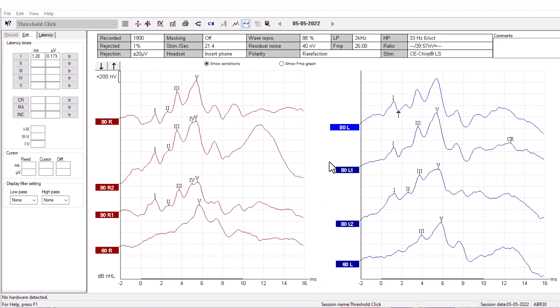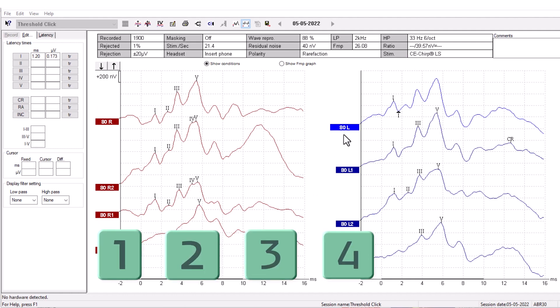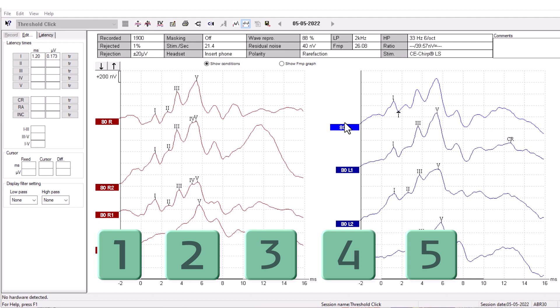For easier access to the wave markers, you can also use your keyboard by pressing 1, 2, 3, 4, or 5 to place the corresponding wave markers.